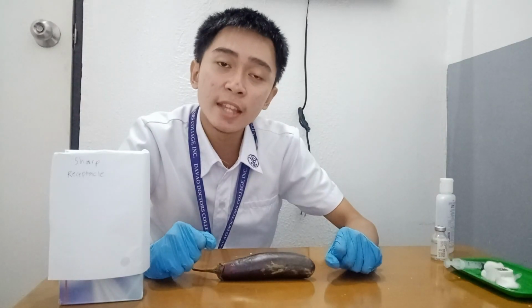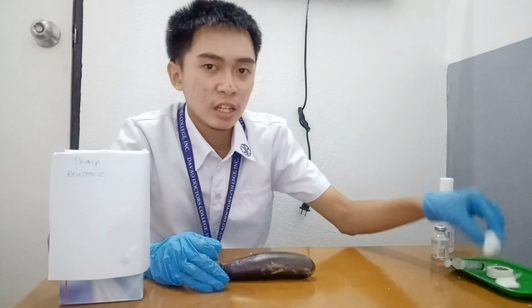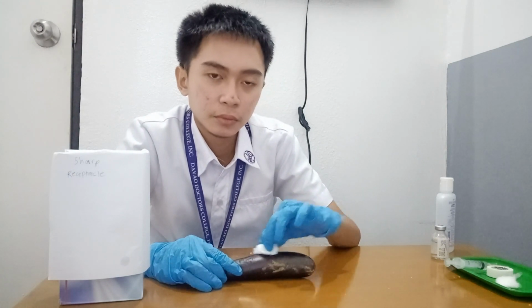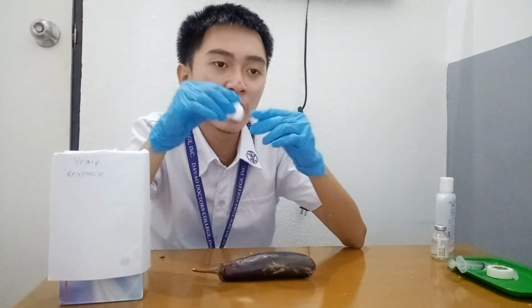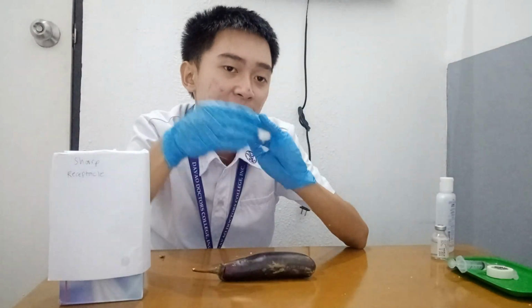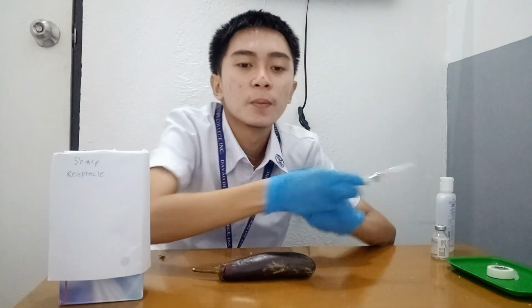Clean the site with an antiseptic swab using a circular motion. Start at the center and move outward about 5 centimeters or 2 inches. And transfer and hold the swab between the third and fourth fingers of your non-dominant hand in readiness for the needle withdrawal, or position the swab on the client's skin above the intended site. And prepare the syringe for injection.